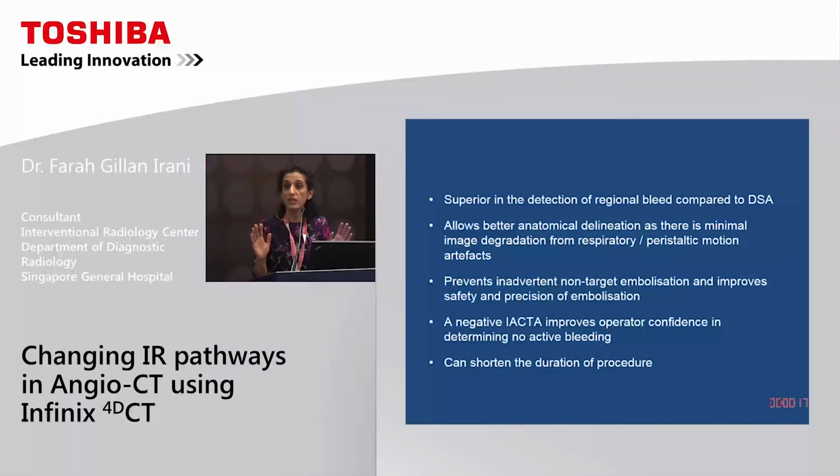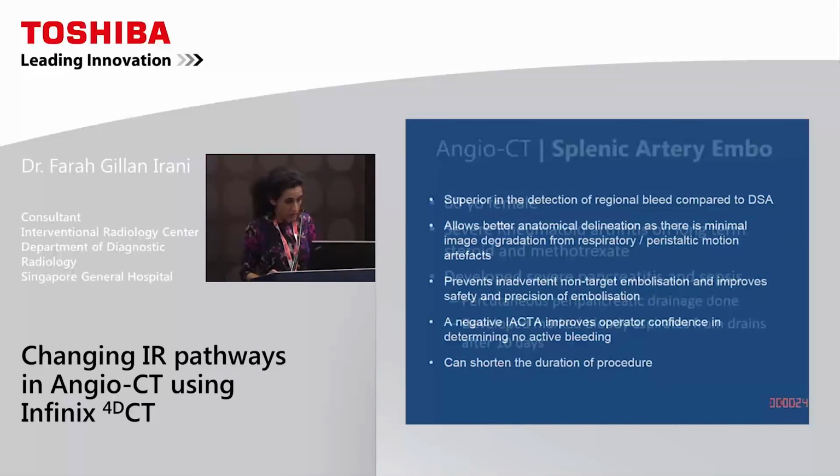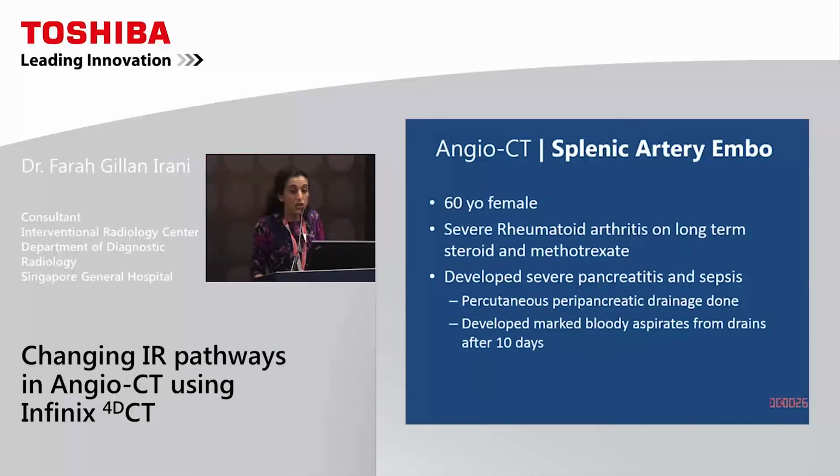If we don't see any bleed, we actually stop the procedure and send the patient back. So in this way, we shorten the duration of the procedure, and we shorten the amount of contrast that he gets. And my last case is a splenic artery embolization.